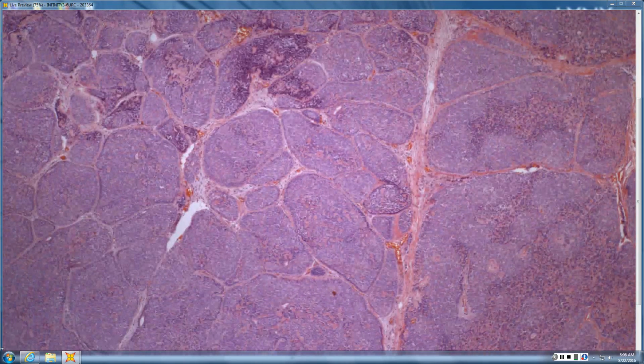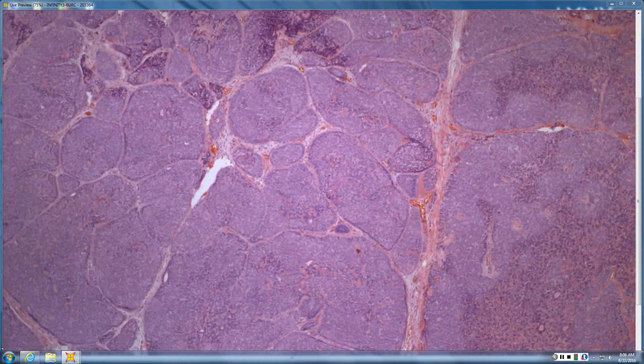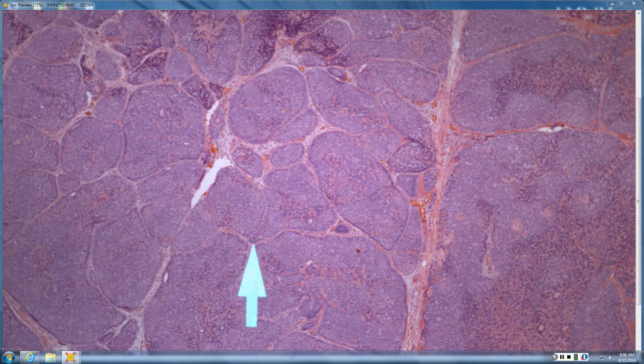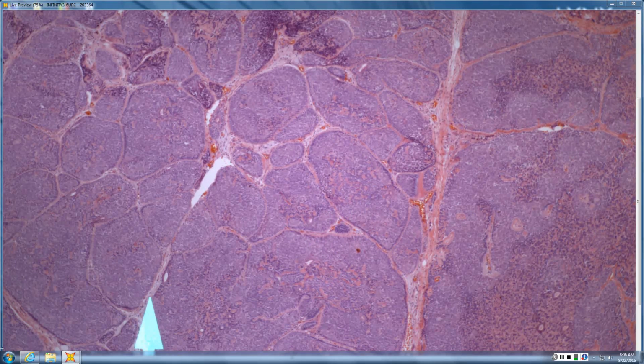So this appears sort of jigsaw puzzle-like, like I was thinking of cylindroma. So they are blue island cells that have very little cytoplasm, but they are surrounded by red basement membrane zone that separates the jigsaw puzzle pieces, and there are little droplets of basement membrane zone material within the tumor. And the tumor itself is composed of two cell types: darker gray cells at the periphery, paler gray cells towards the center, and it is not inflamed with lymphocytes. So this is a cylindroma, as you said.